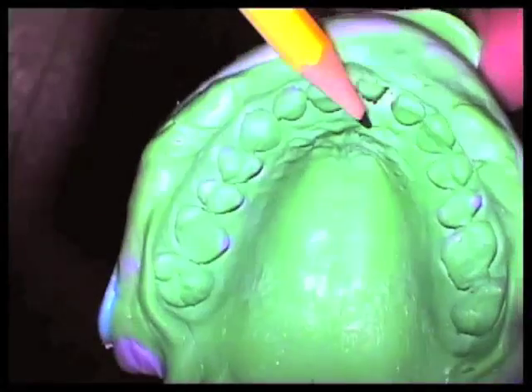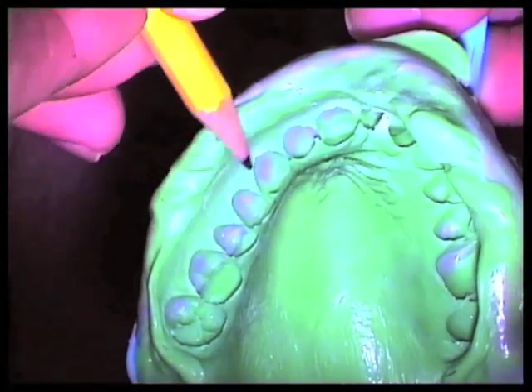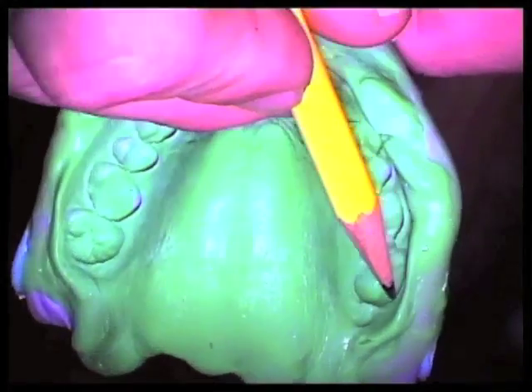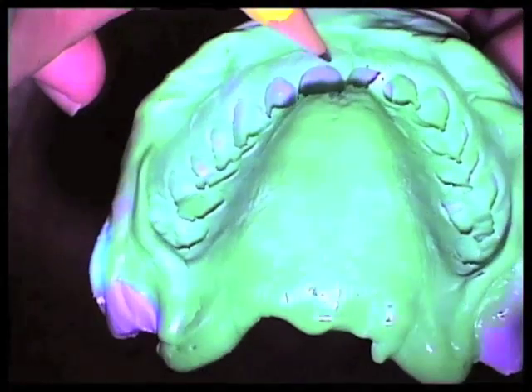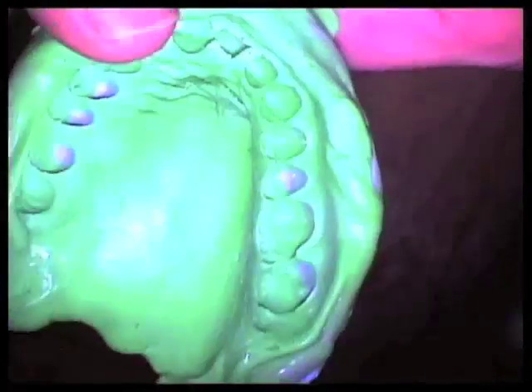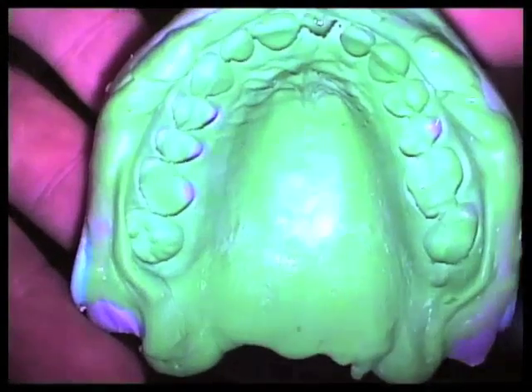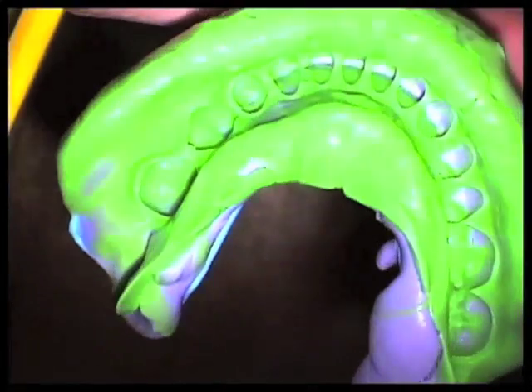Make sure that all the teeth are captured, that we've got our free gingival margin on the facial and lingual surface, and then we've got good soft tissue, good land areas well above the free gingival margin, buccally and lingually. So that is a really nice maxillary diagnostic model.